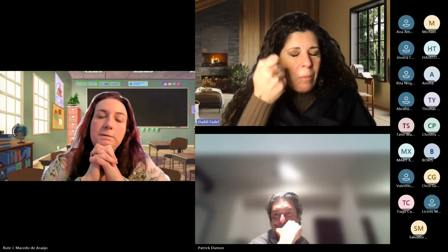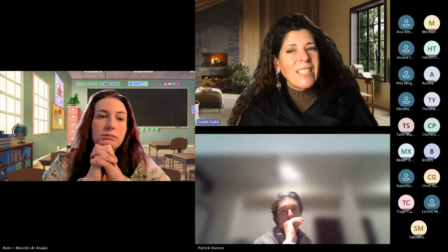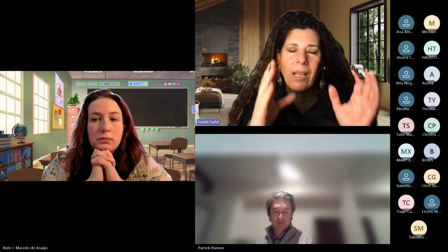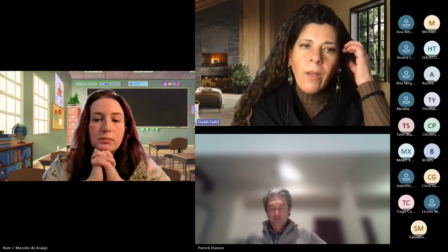Yes, you made a great point. Sometimes with these patients, the first thing is to reduce lens diameter, but you made a great point that you don't like going less than 16 millimeters, because if you reduce lens diameter, it will be easier to apply, but you may be touching the cornea or the limbus. So this is not always a great option. The lens diameter depends on the HVID. You have to vault the cornea and the limbus and land only on the conjunctiva. If they have problems applying a 16 millimeter lens, which is proper for them, you have to educate them properly, increase the number of sessions in applying, and use all the devices that you have explored in this presentation.